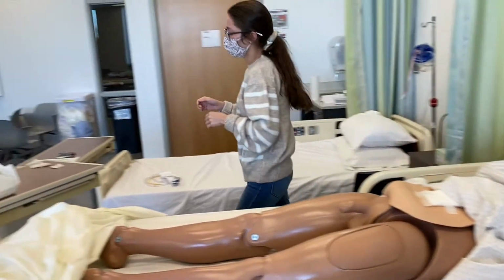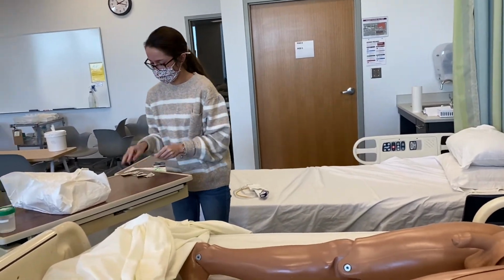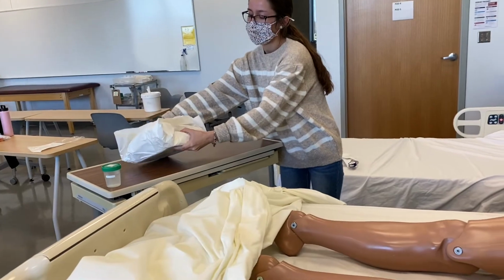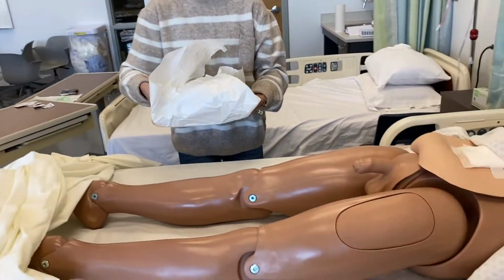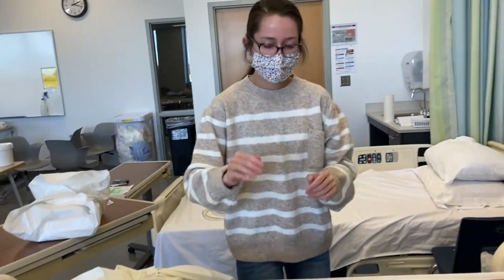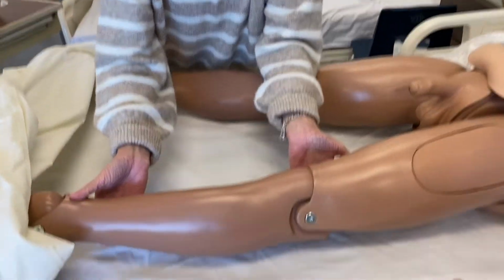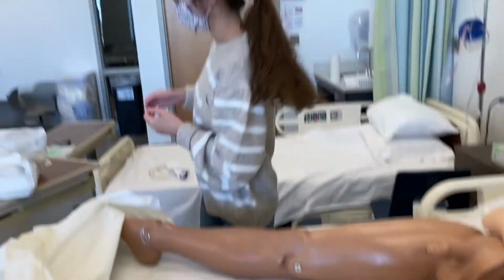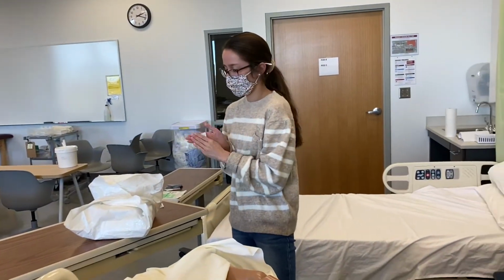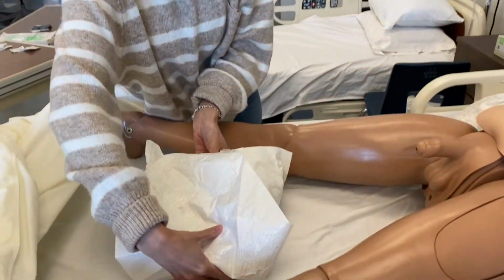Okay, I'm going to perform hand hygiene. I'm going to grab my kit. Okay, well first I would have abducted his legs out. And hand hygiene again. Alright, and now I'm going to set up my kit.